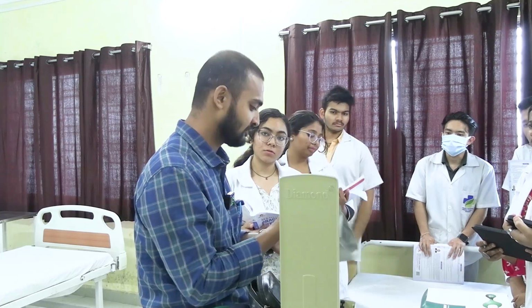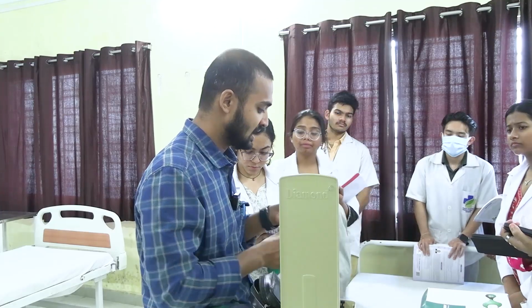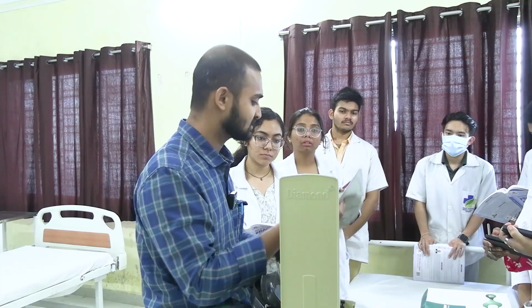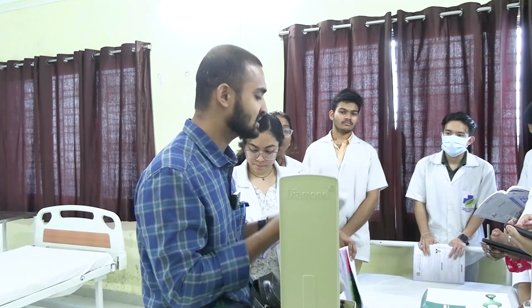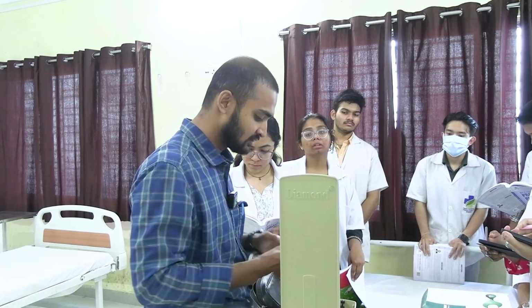This is the non-distensible cuff, also known as the Riva-Rocci cuff. This is non-distensible, and inside it there is a flat, inflatable rubber bag. It is like the envelopes you have seen, given to submit an invitation or something. There is an envelope covering the rubber bag. In the same way, this is the dial with the graduations.